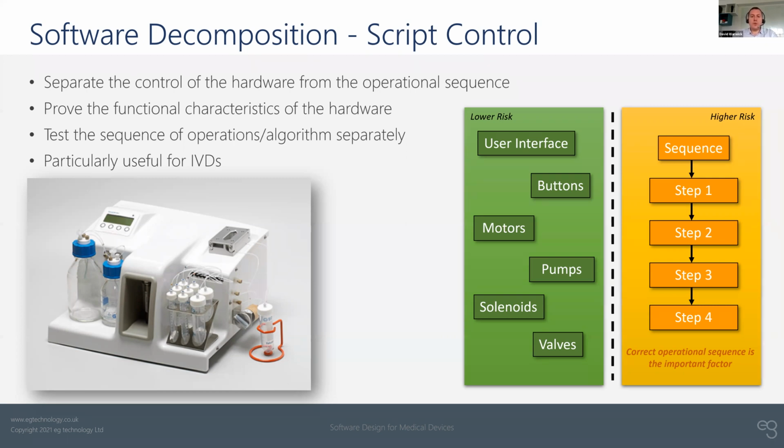But a change in the order of operations needed clinically doesn't necessarily require a complete software retest, because you've already determined that each of those functional components is going to work correctly, provided that the instructions that you give it are within the overarching acceptable parameters.